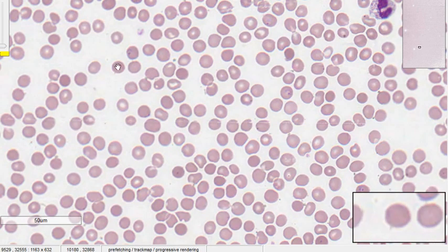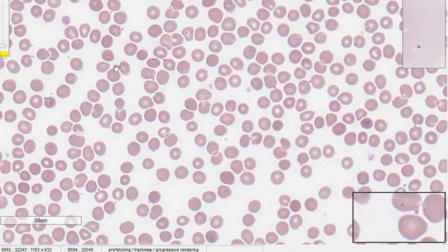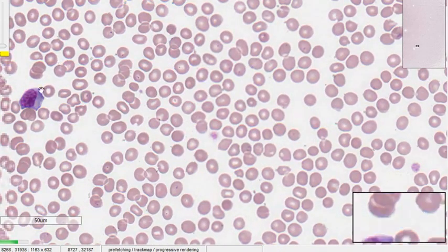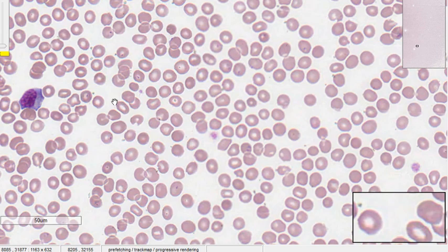So you can comment on all the series, the RBC series, the WBC series, as well as the platelets. So that's it. Thank you. This will be enough, I guess, and I hope all of you have reached a diagnosis of your own by now. All right.